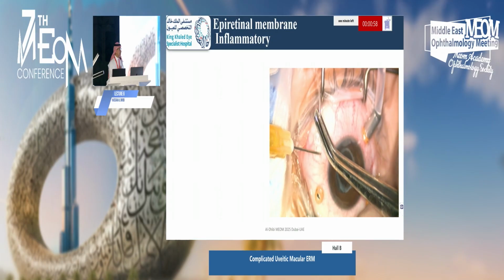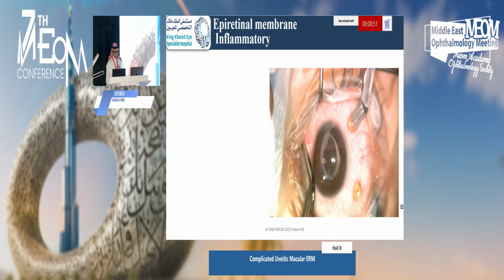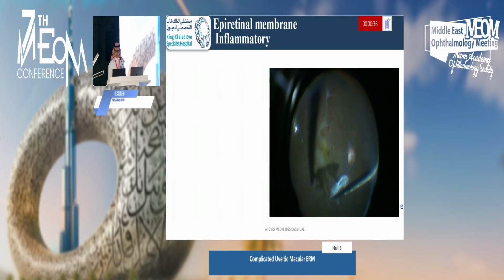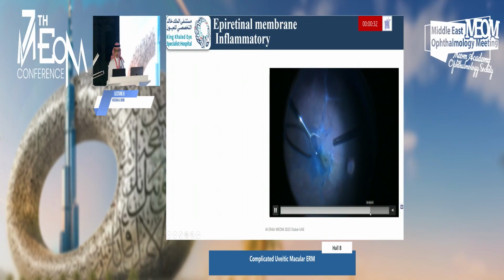Now I'm getting the chandelier. This is the chandelier that I use. It's flexible and helpful, not as stiff as the others from Alcon. So we get it in, and I'm starting to use the pick manually. When getting in, it's easy getting out. Now the second step, after that, is removing this membrane. So getting out, now starting to go for the ILM.